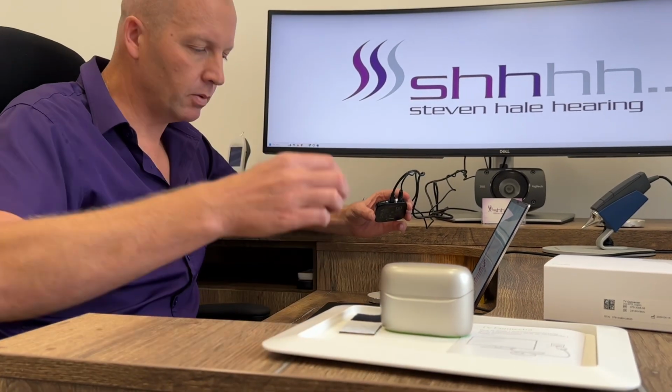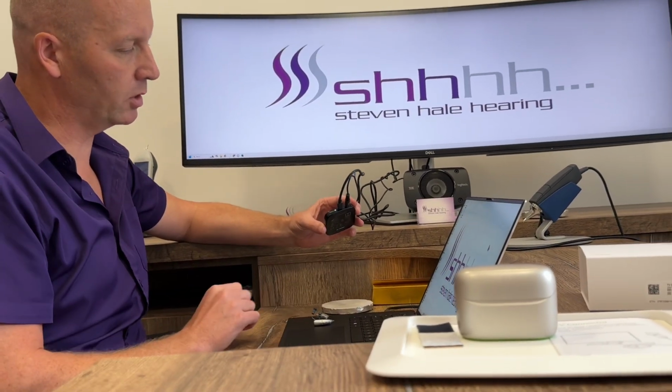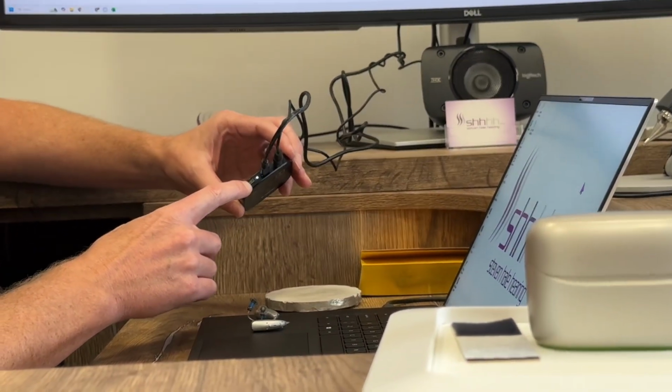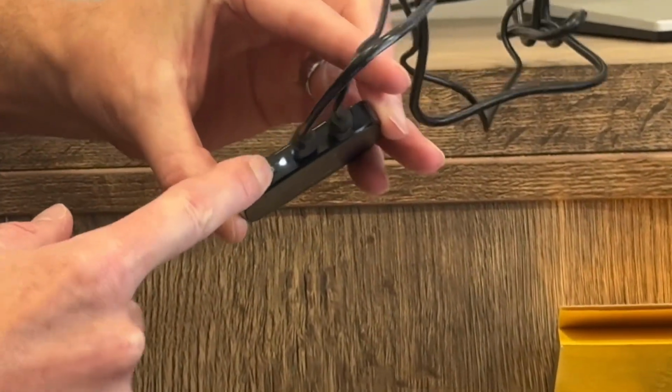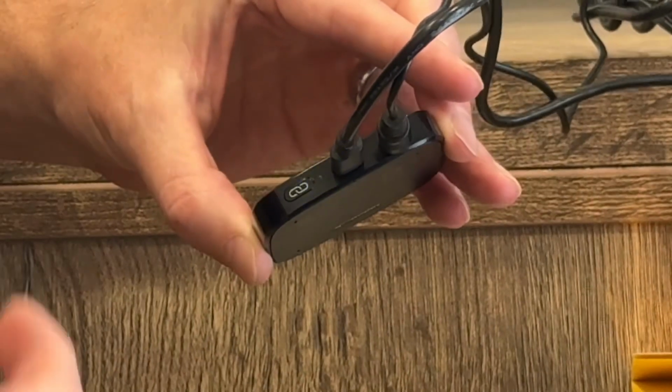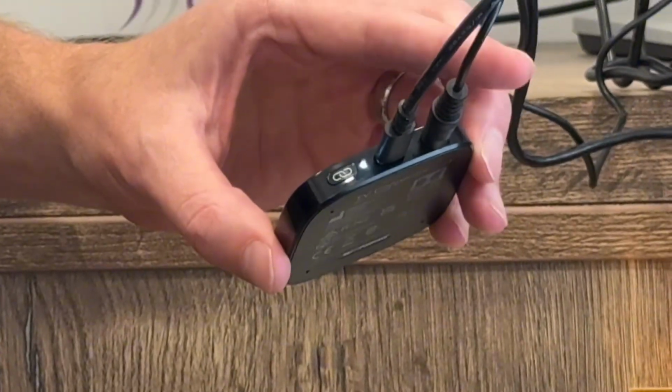With your hearing aids, which you're most probably going to be wearing, I'm going to just pop these hearing aids here just for the demonstration, so these are switched on. You press the link button on the back, press that there, and you will get an audible noise in the hearing aids, and that will confirm that the hearing aids have connected up to the TV connector.